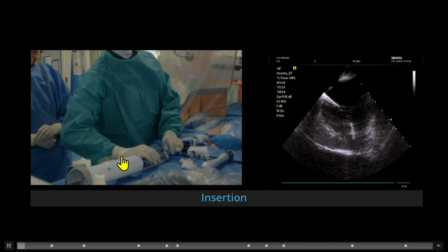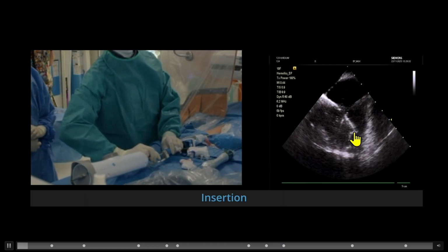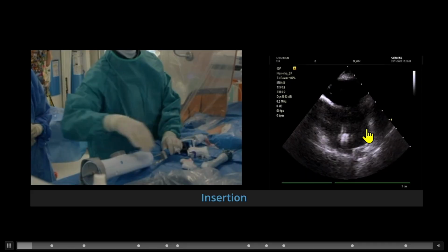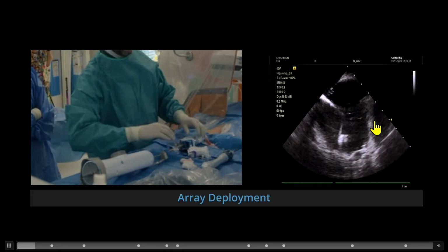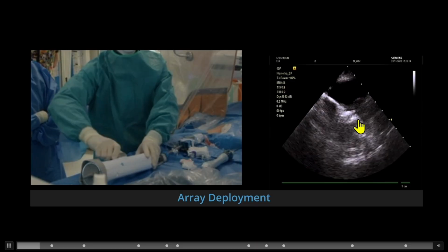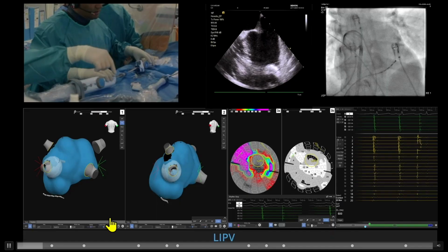So this is the assembly. There's a deflectable sheath here. And here you can see it's being extruded out in the left atrium. I like to always look at it with ICE because then you have a very easy understanding of where the device is relative to the anatomy. And then when you rotate this knob, it becomes the actual globe. And now you're ready to map.